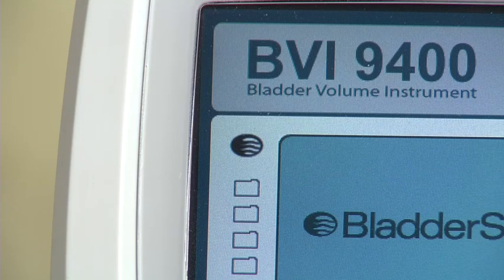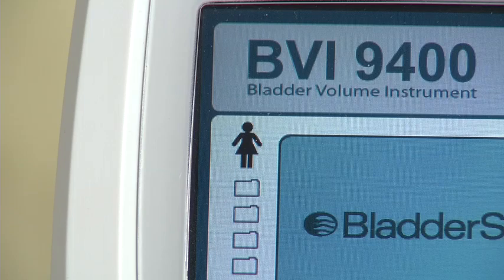Select to scan a male patient or a female patient who has had a hysterectomy. Select to scan a female patient who has not had a hysterectomy. Or select to scan a small child under 48 inches (122 centimeters) tall and weighing less than 60 pounds or 27 kilograms.